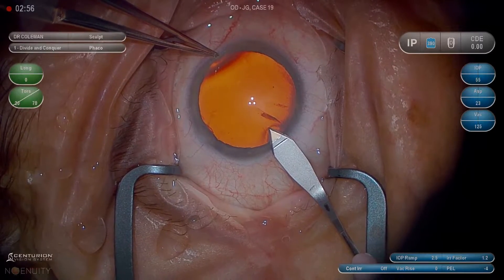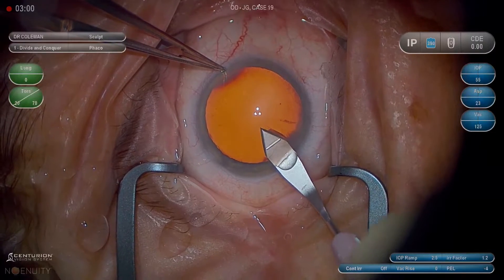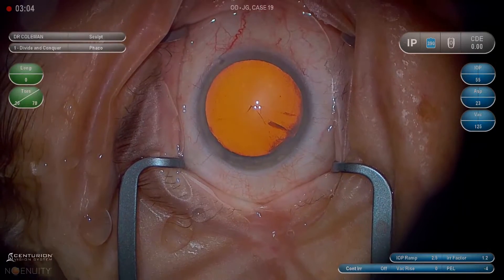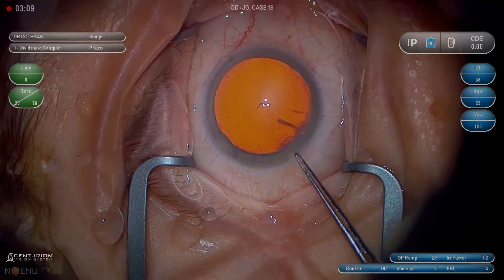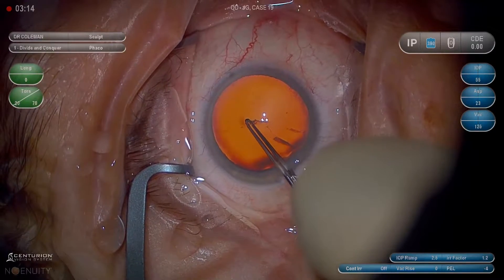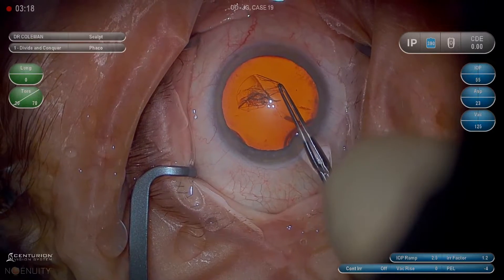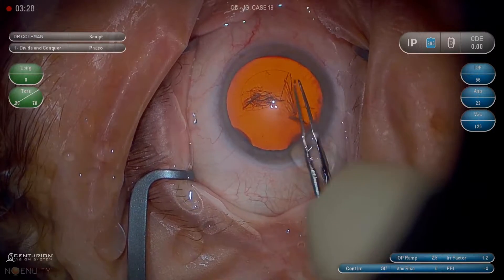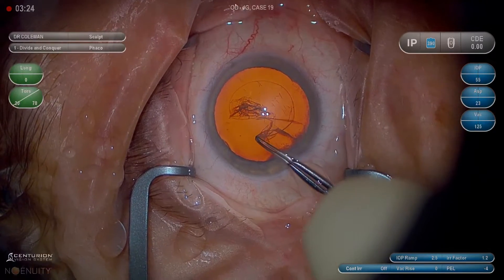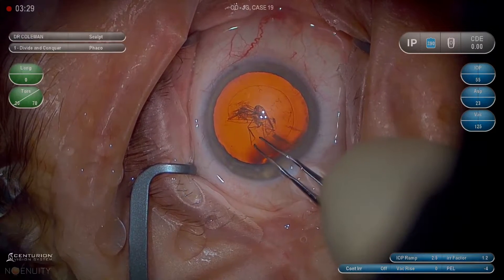I like to puncture the anterior capsule with the keratome. I think this gives me a better starting point and more control at the beginning of my CCC, and then grasp. We like to minimize the number of regrasps — in other words, get as many clock hours as possible per grasp, because that improves your time and eliminates the risk of having trouble regrasping midway through the rhexis.